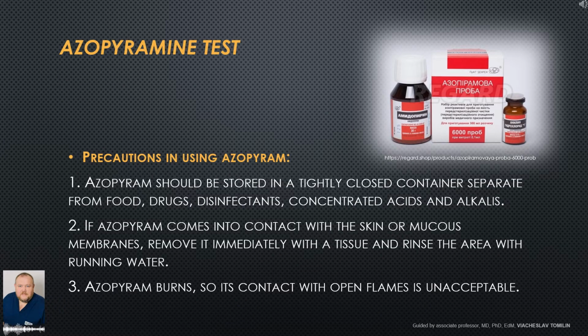Precautions in using azopyram. 1. Azopyram should be stored in a tightly closed container separate from food, drugs, disinfectants, concentrated acids and alkalis. 2. If azopyram comes into contact with the skin or mucous membranes, remove it immediately with a tissue and rinse the area with running water. 3. Azopyram burns, so its contact with open flames is unacceptable.